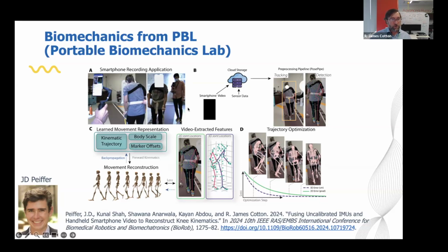But the short version is we have our smartphone platform, which you're seeing here. We tend to record people with a gimbal just to make the video smoother. And then similarly to what we described earlier, we're getting the 2D key points from that computer vision. We also are using an algorithm called Metrabs from this great guy, Istin Sarandi, that does a very good job of computing both 2D and 3D key points. I don't want to get too much into it, but this paper used a very clever approach to combine all the existing data sets with images and 3D data to produce a Rosetta Stone and map between them and really get high quality kinematics or 3D joint locations.